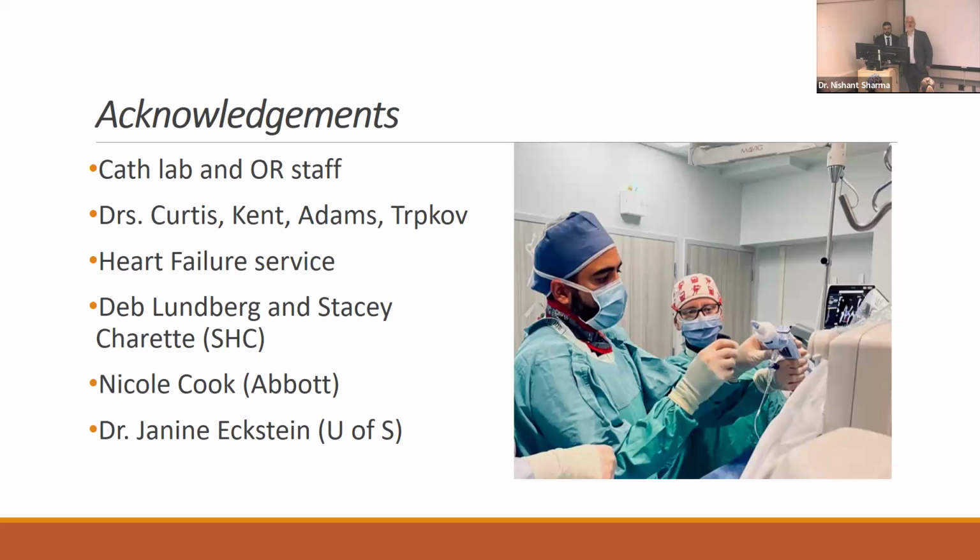One question. Yeah, go ahead. Nice presentation, great images. Some of those complications you showed where you get a single leaflet device attachment, is that all intra-procedure or is it usually down the line? It's hard to predict upfront. So Dr. Kuryachin asked about some of those device-related complications. Are they things that we can see in the OR? Are they things that we see in follow-up? The one that we've had was in follow-up.